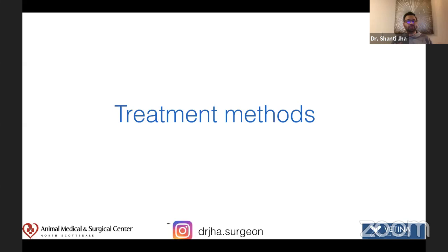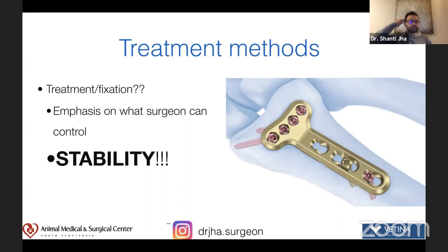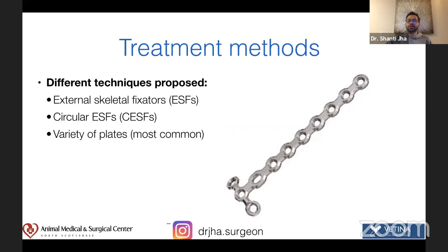So let's discuss a few things here. So in all, what we are trying to do here is create a proper stability. So this is a wrist joint of a human, and you can see the plates being put, and on the distal fragment, there are four screws, and then on the proximal, there's of course a couple of screws there stabilizing it. So that's what I think we need to do and properly fix it. So there are different techniques that we can use: external fixator, circular external fixator, and then different varieties of plates. What are things that we should not do?